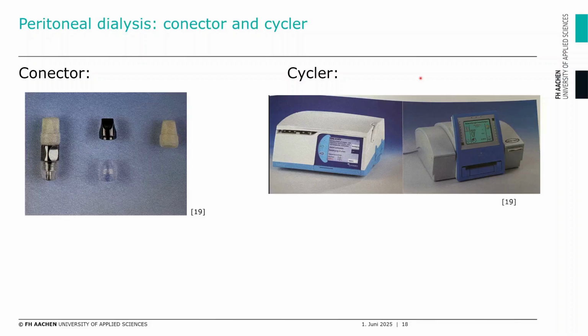The tubing system is manually connected to the bag system, and the tubing cassette, with various valves, is inserted into the cycler. The patient connects to the device in the evening. If there are any failures during treatment, the device issues an alarm. The ultrafiltration volume is then saved and can also be read out via chip in the PD center along with all other data. And the PD can be carried out at home.